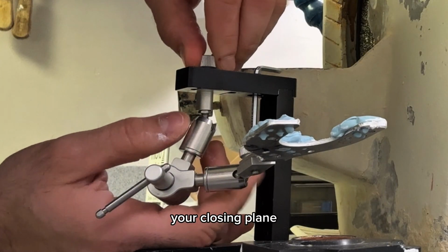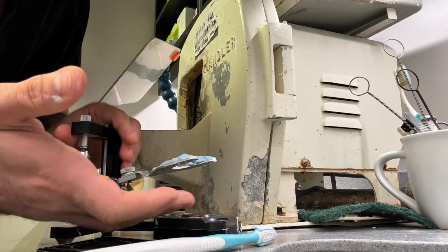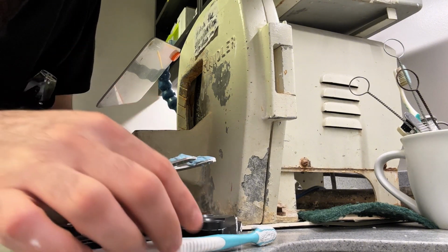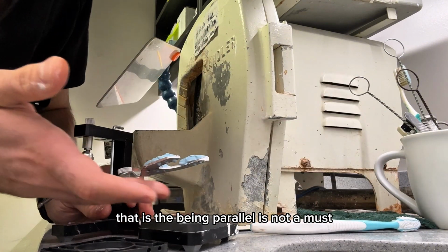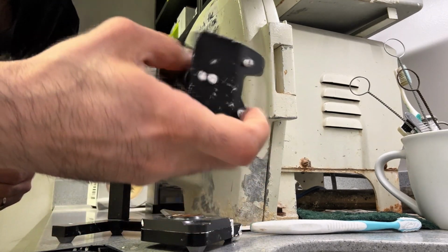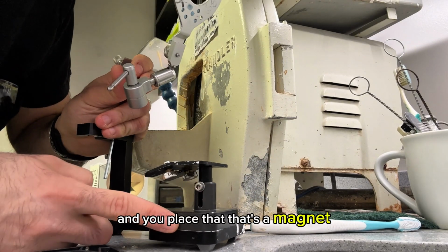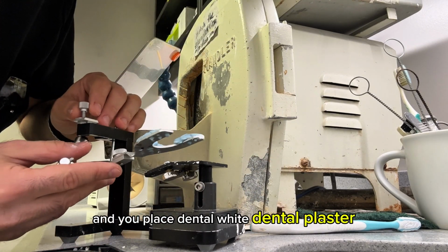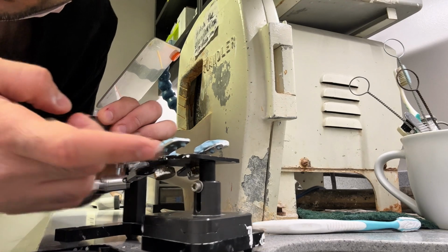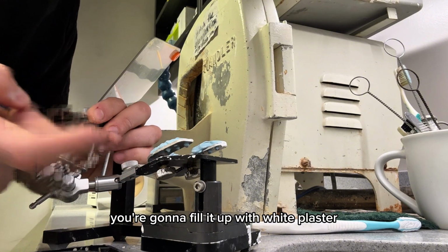Your occlusal plane may not necessarily be parallel to the base. As you can see, this is a little angled, so being parallel is not a must. And you place a magnet, and you place white dental plaster, the cheapest you can get. Right now you see the space here. You're gonna fill it up with white plaster.